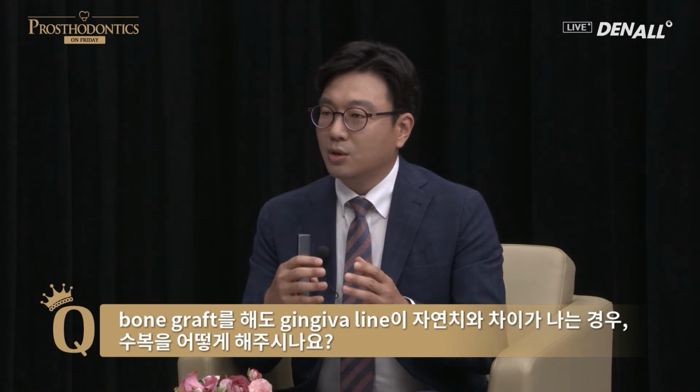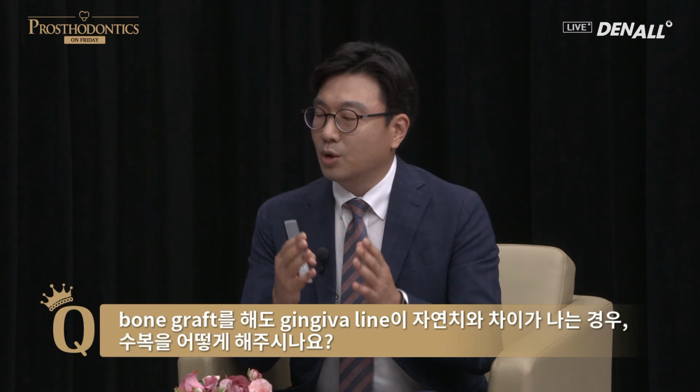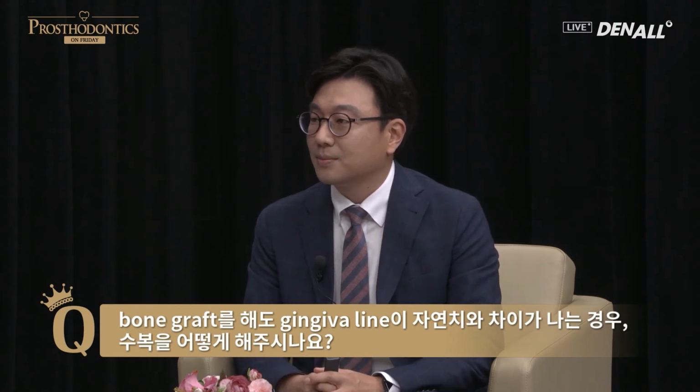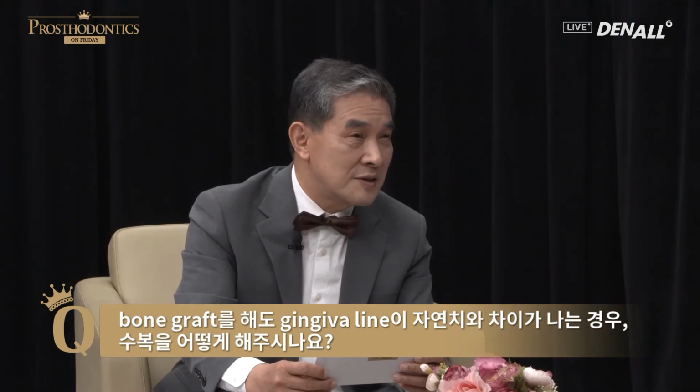Yes. Before we go to the final, we can go through the provisional stage to push out the gingiva as much as possible. Anyway, provisional restoration can play an important role aesthetically and for healing. So we need to utilize provisional restoration. Another question?